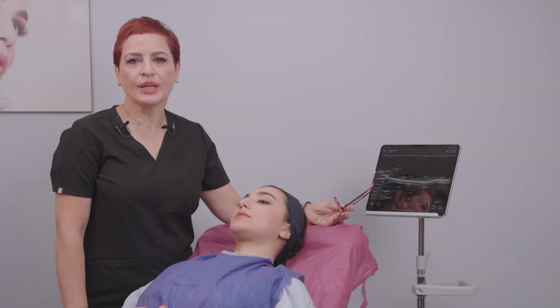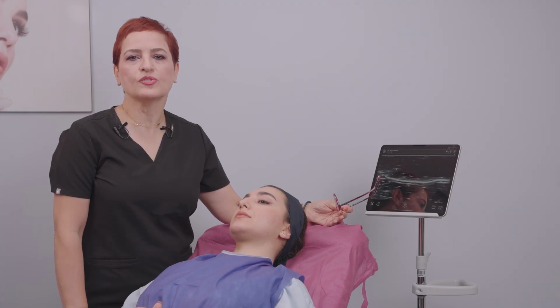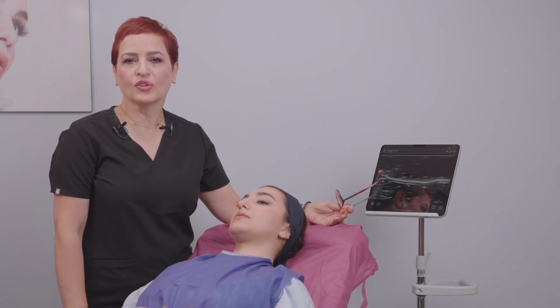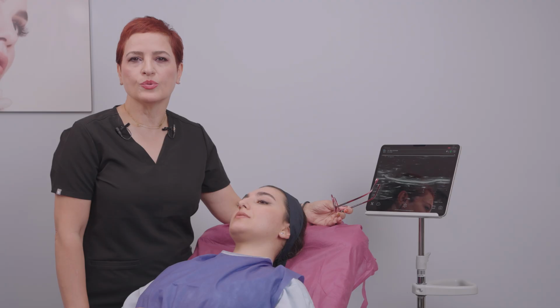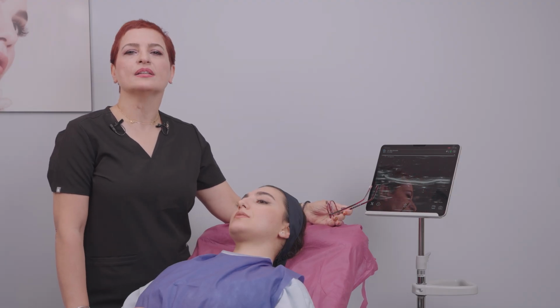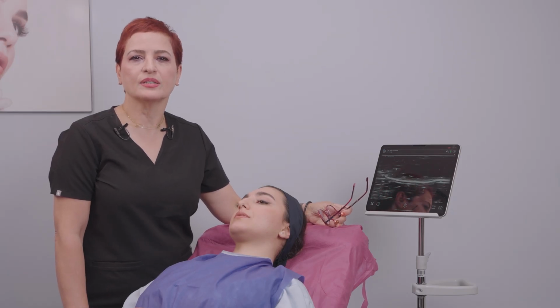We are exploring the importance of ultrasound guidance in facial aesthetic treatments, combining precision, safety and artistry. I'm Dr. Roya Zarmezamin, and today's session is about assessing and exploring different layers of the skin. Why is it important to see, assess and scan the different layers of the skin? Because we can check the patients for any aging process of the skin, damaged skin versus intact skin, and tailor customized anti-aging treatments.